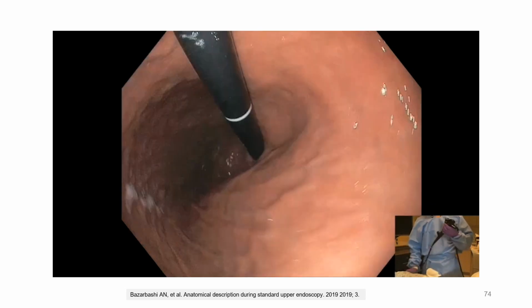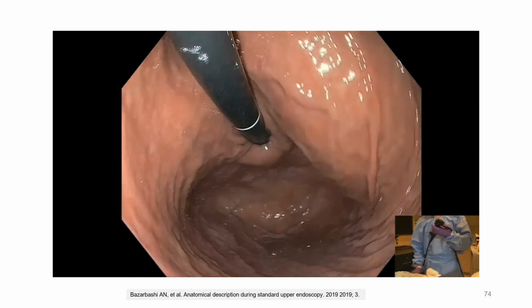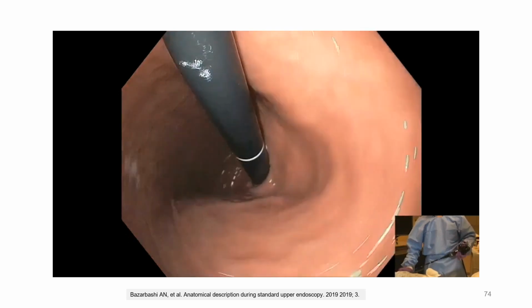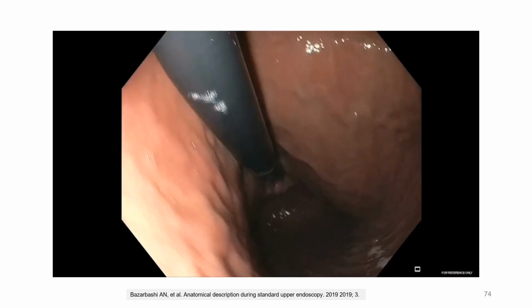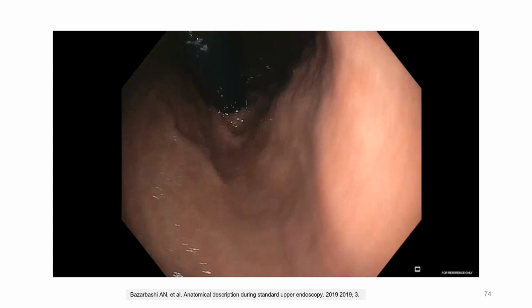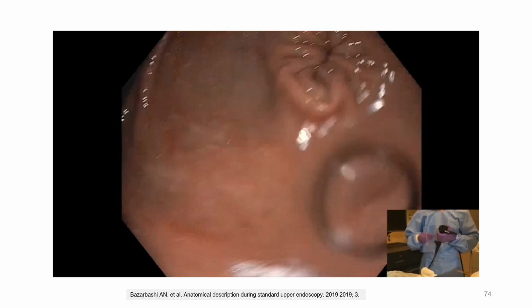Once in retroflex position, the endoscopist can use the small and large dials or torque the right and left hand to maneuver the endoscope to evaluate a 360 view of various anatomical landmarks, including the gastric incisura, gastric fundus, the gastric cardia, and gastroesophageal junction. Common pathologies seen on retroflexion include hiatal hernias, Cameron erosions, and gastric varices.